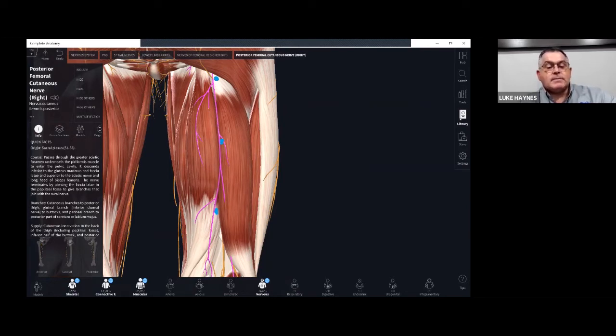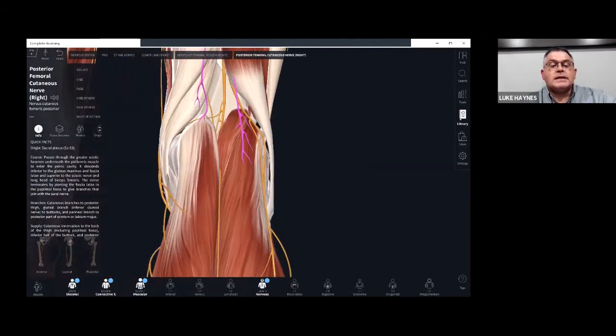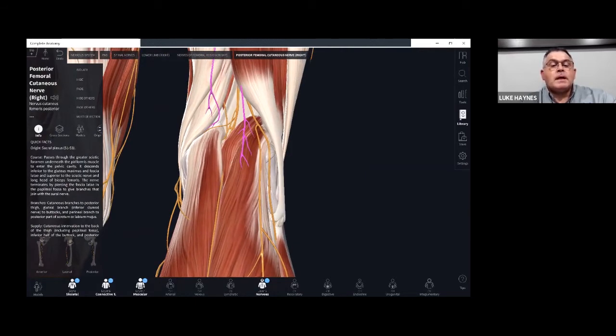aspect of gluteus maximus. We're going to drop further to where the muscles separate at the top of the V notch, where we would normally needle our medial lateral hamstrings, and we'll drop a needle there. And then we're going to find a space midway between to needle there. As you can tell, it continues further distally, which we'll address further in the lower leg.